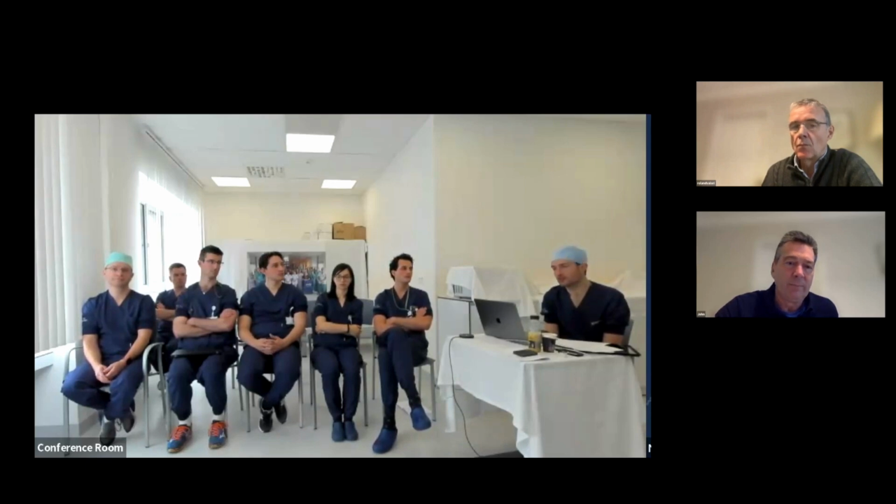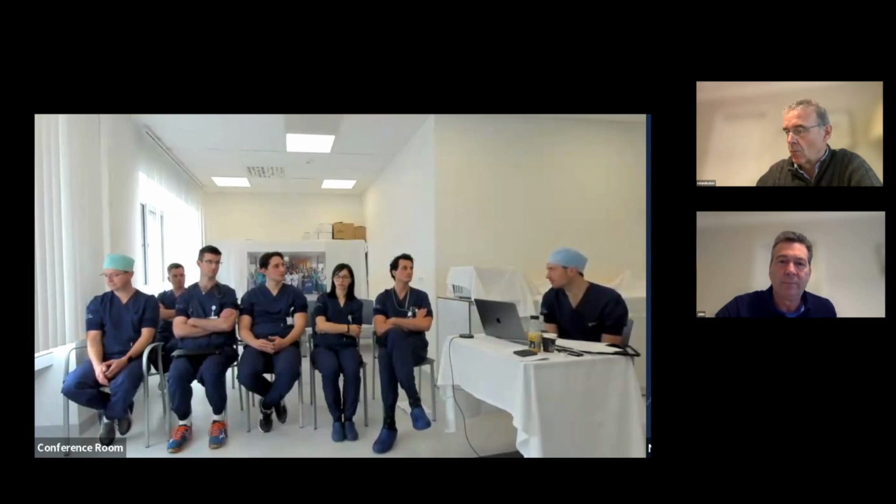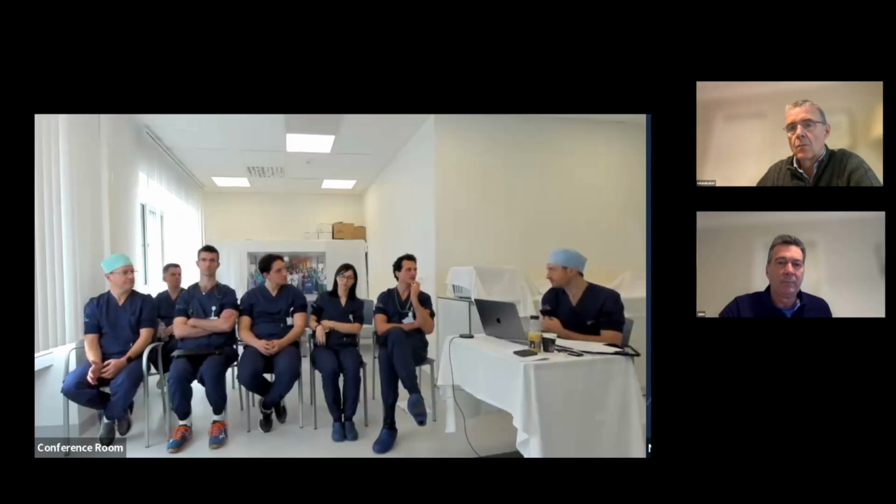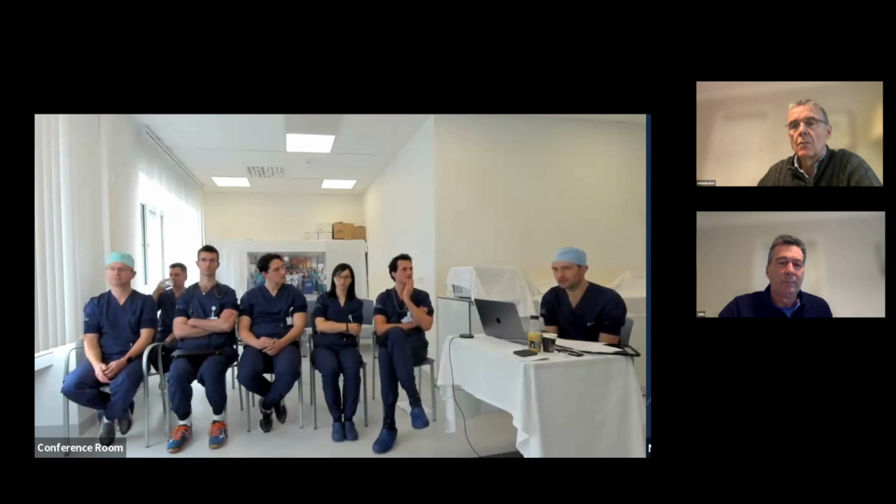Yeah, I think that's probably fair. I think the studies are probably biased in that regard, aren't they? All being from centres where these things are commonplace and sent up, etc. But nevertheless, that doesn't take away from any of this, because good practice is good practice. Comes back negative. I don't know. This is a very common finding in this. Particularly, I think that all of the biopsies that we would have taken today would have come back as atrophic gastritis, potentially some of them with intestinal metaplasia.